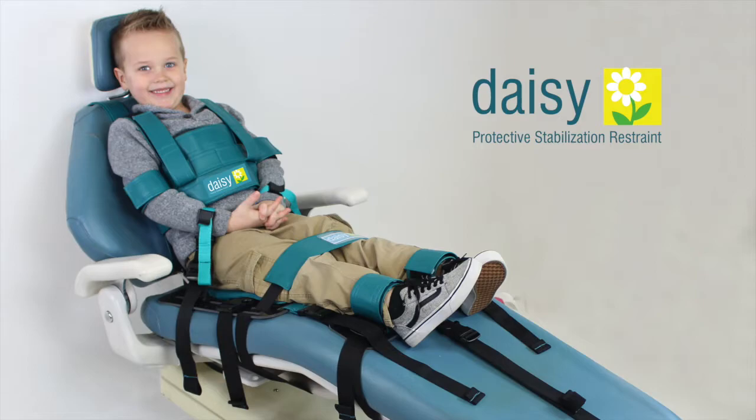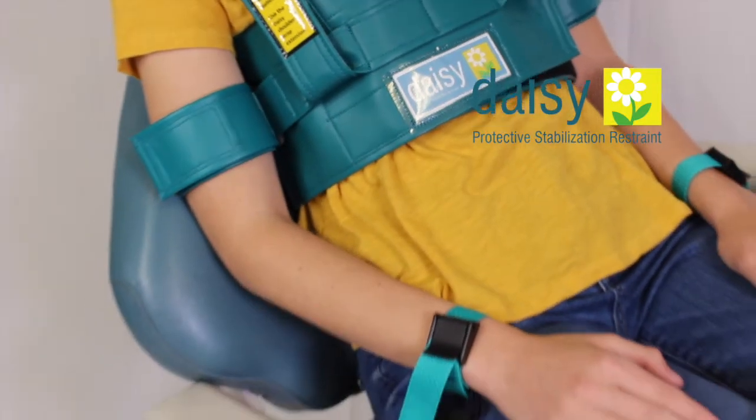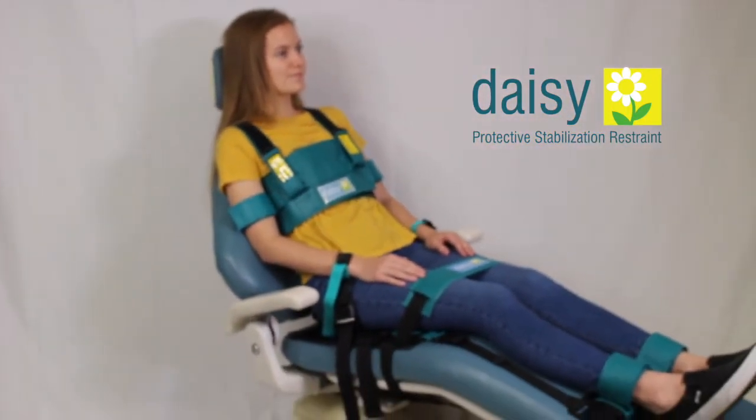DAISY chair. Depending on the patient's healthcare needs, you can choose to use the features you feel are necessary to protect the patient and staff personnel and provide a good experience for the patient. The DAISY PSR needs to be installed on the dental chair before the patient arrives. Installation of the DAISY PSR to the dental chair is covered in the previous video.